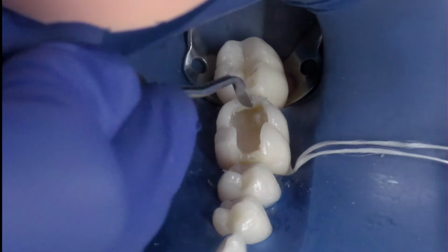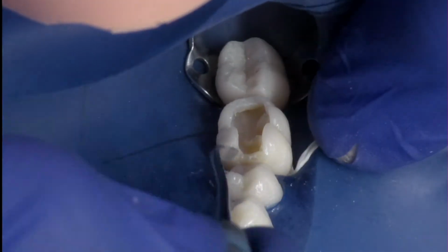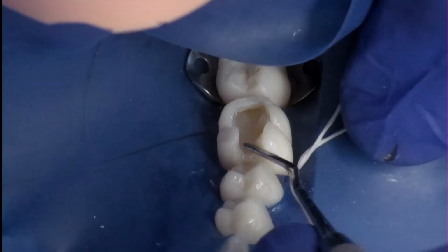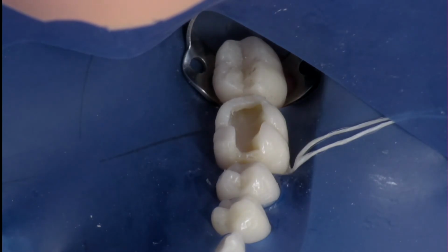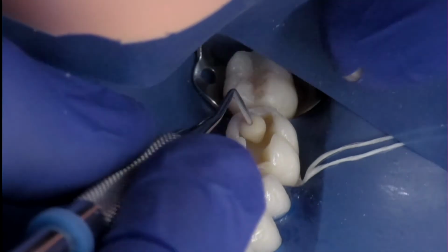But I kind of ended up moving the composite to flush with the cavosurface on this mesiobuccal cusp. Why I did that, I'm not quite sure. It just seemed right at the time, and I kind of regret it later on. If I were to do this again, I think I would use a larger ball at the beginning just for time's sake, and I think I could still have a good looking tooth with a larger increment.